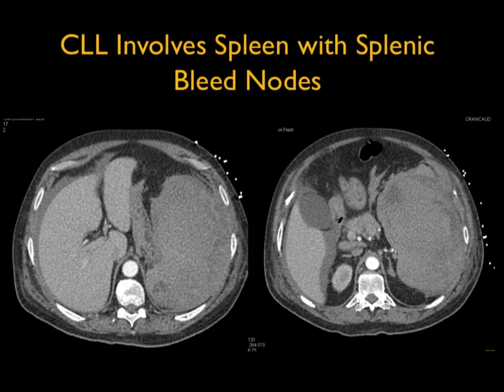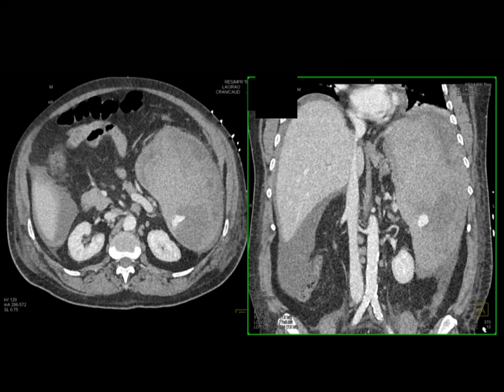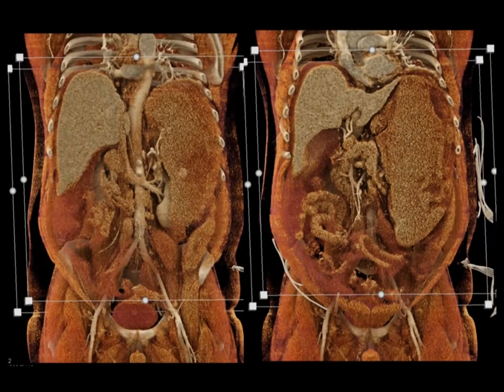One of the complications of a large spleen is spontaneous bleed without trauma. Good example here: large spleen in CLL with flank pain and a positive bleed sign — you can see the blush, so this patient is actively bleeding into the spleen. The patient may end up with a splenectomy. You can see the subcapsular collection, the active extravasation, all very nicely shown on 3D mapping and cinematic imaging.